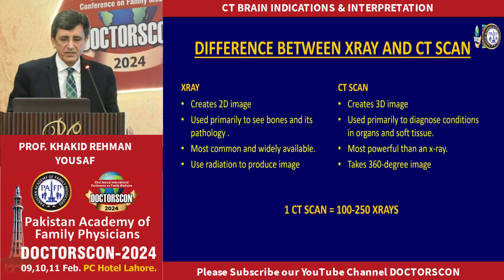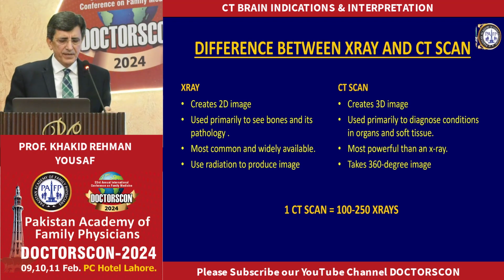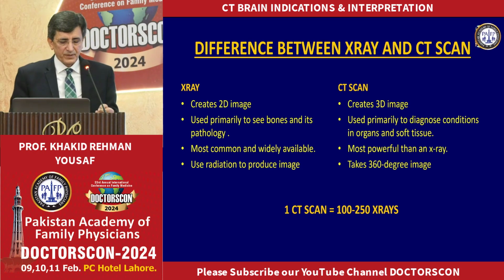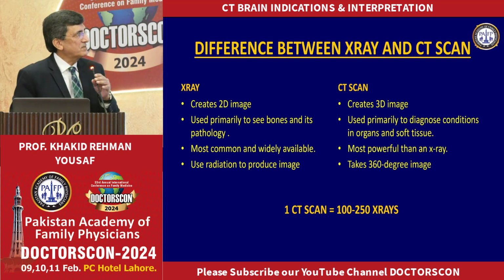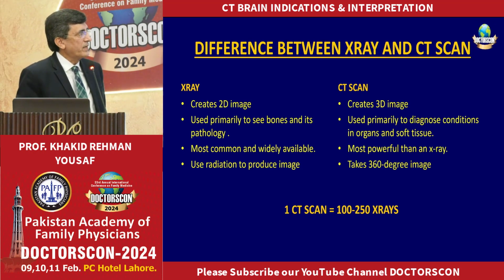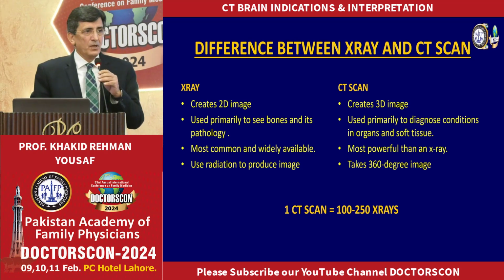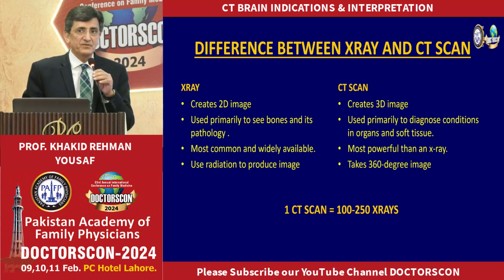A few words about the difference between what an X-ray is and what a CT scan is. In X-ray, we create a 2D image, and it is used primarily for bones and their pathology. We can't see the soft tissue or the brain on X-ray, but a CT scan creates a 3D image used primarily for diagnosing conditions in organs and soft tissues. As I told you, there is a 360-degree rotation of the X-ray tube which takes the image. But please mind you, one CT scan of the brain is equal to 100 to 250 X-rays of the skull.